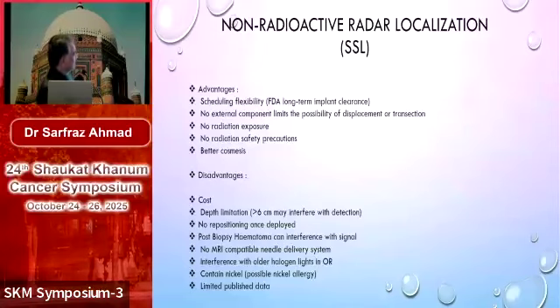Now the advantages: it gives you scheduling flexibility. FDA has approved it for long-term implantation. It means this can be deployed at the time of biopsy as well, so this decreases patient visits to hospital. If a patient is going for neoadjuvant treatment, normally after biopsy, you have to put a clip.